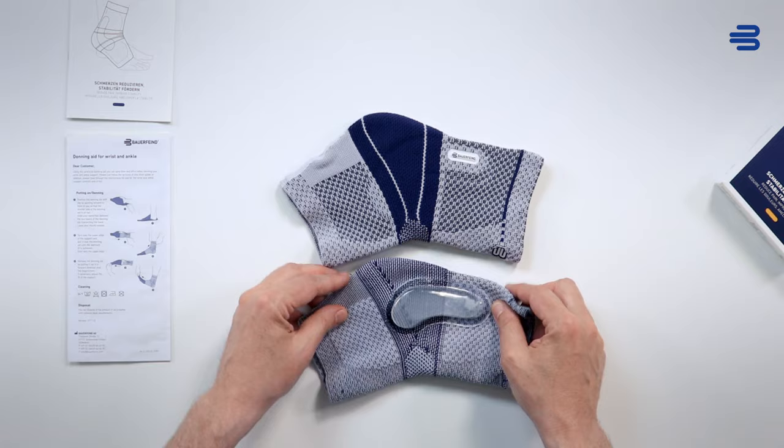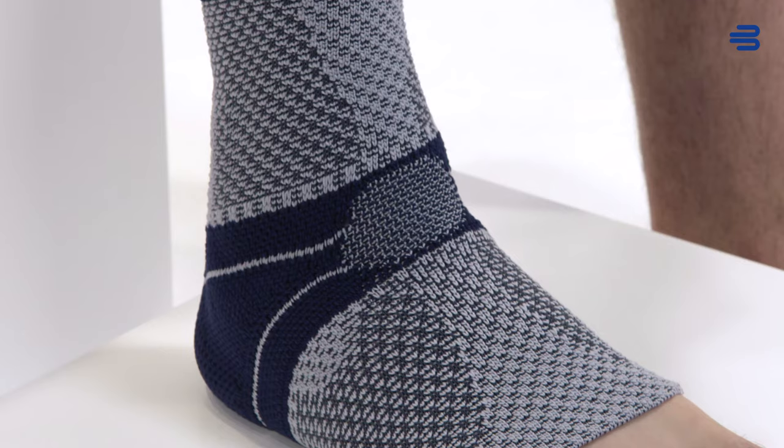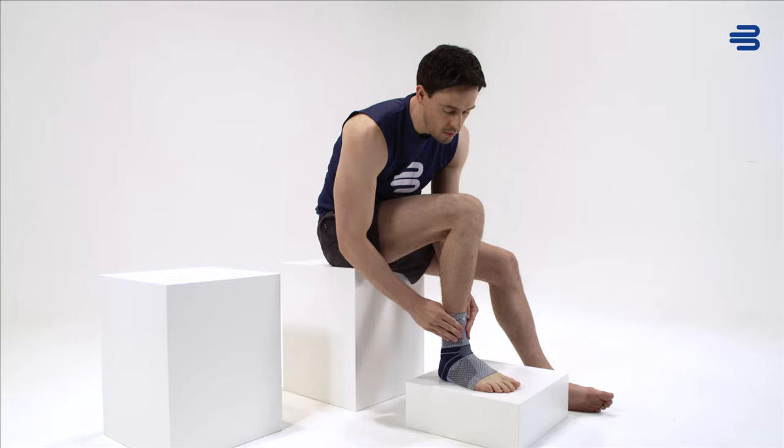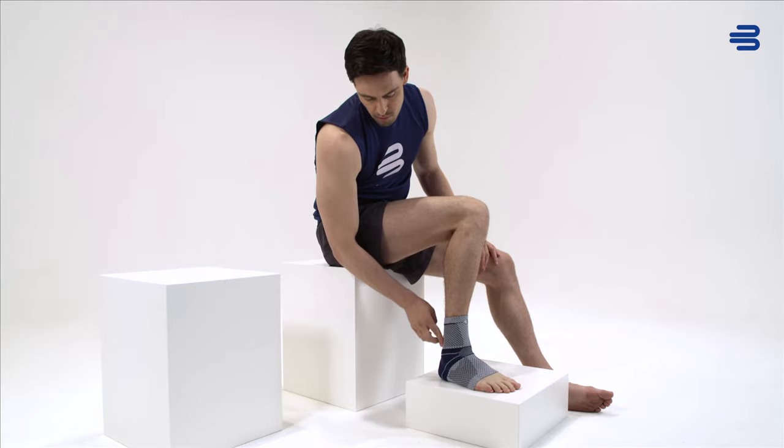The viscoelastic malleol pads have been adapted to match the different anatomical features of the medial and lateral malleoli. They surround the malleoli with a precise fit, reduce pressure peaks around the bony protrusions and promote extensive reduction of swelling and hematoma to support recovery.